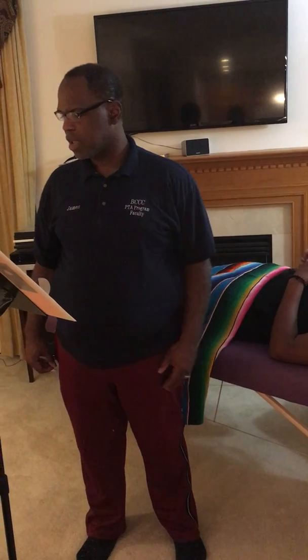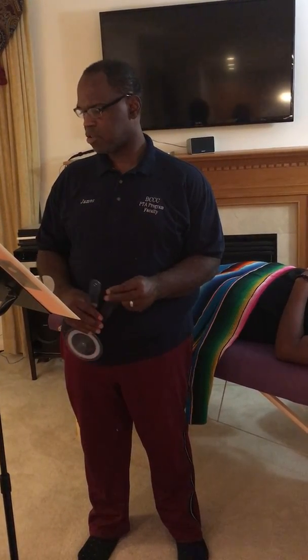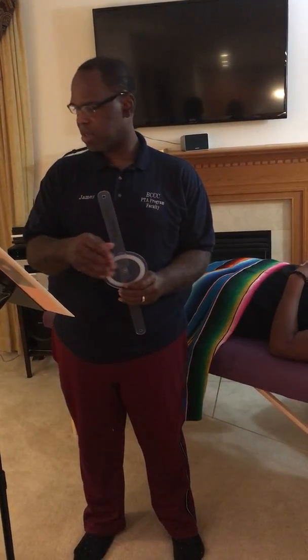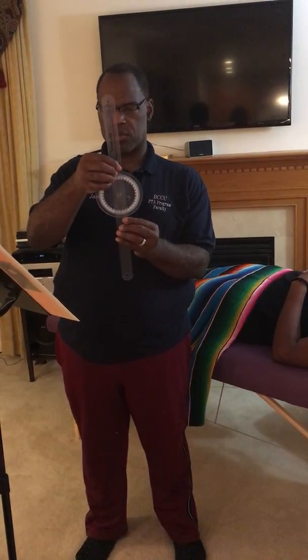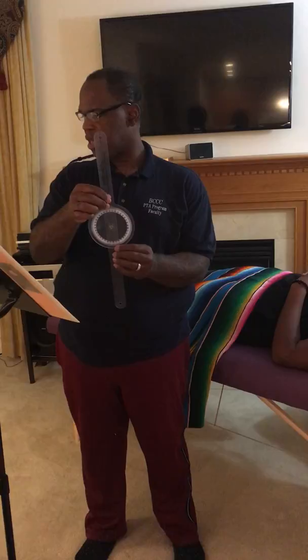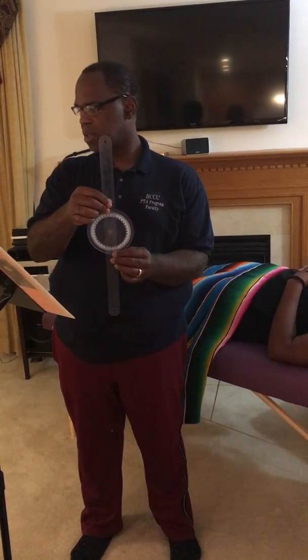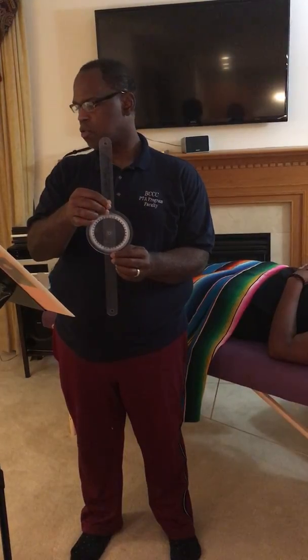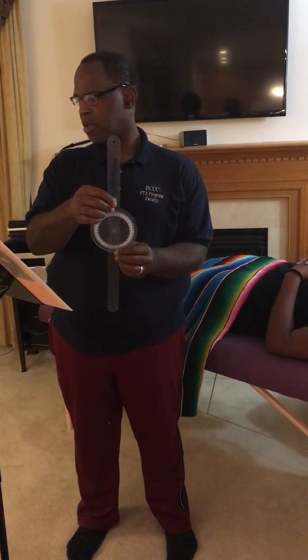All right, let's look at number 3. Reads as 180 degrees. That's also neutral. Now, it says both arms of the goniometer open into a straight line. So the goniometer is open in a straight line. Elbow flexion and extension will be an example. Hip flexion and extension will be an example. Wrist flexion and extension will be an example. Radial and ulnar deviation will be an example. Knee flexion and extension will be an example.